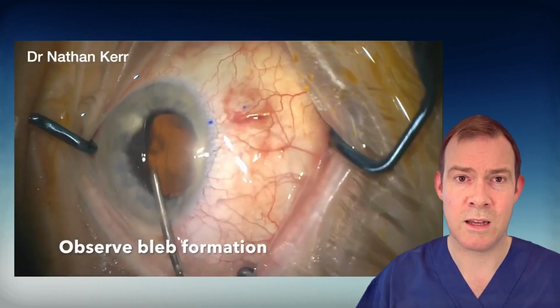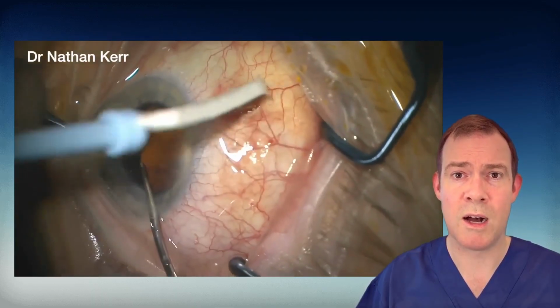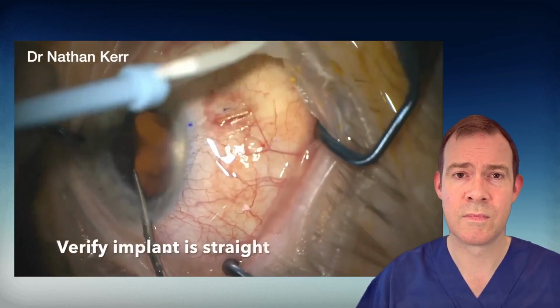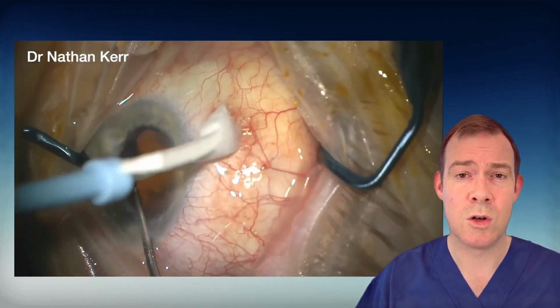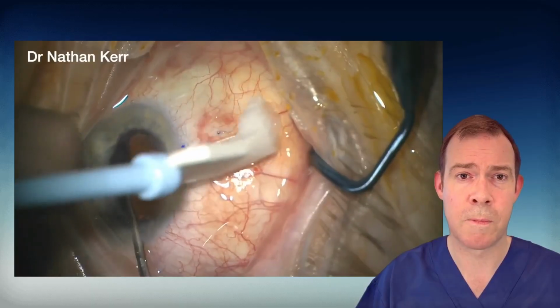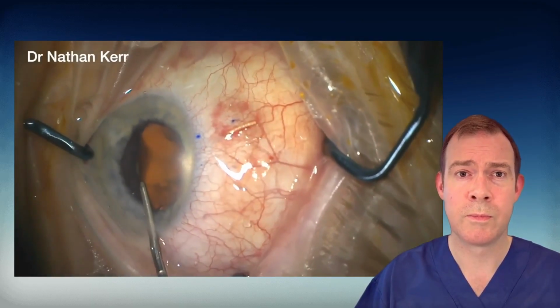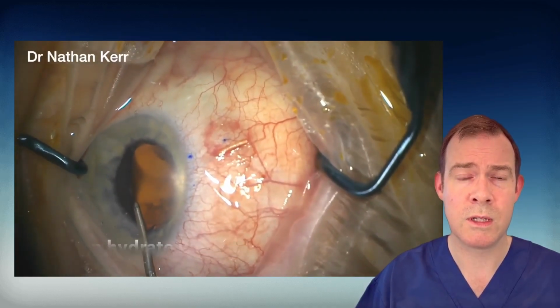Here we can see the low bleb starting to form. The XEN is nicely mobile and is straight. We really want to make sure that the XEN is not caught within tenons. If the XEN is curled in a pigtail type configuration, it should be needled at this point.